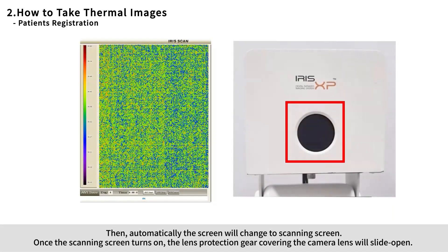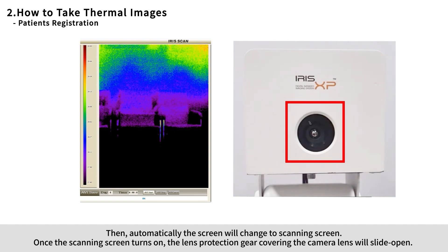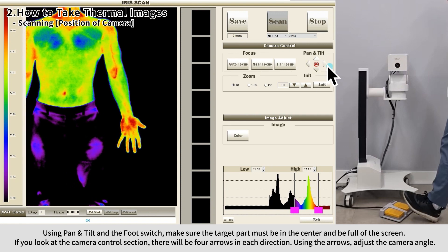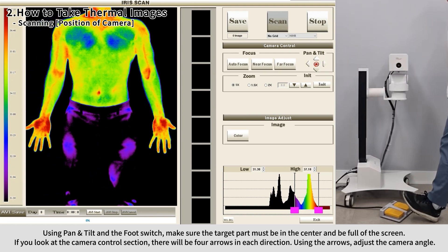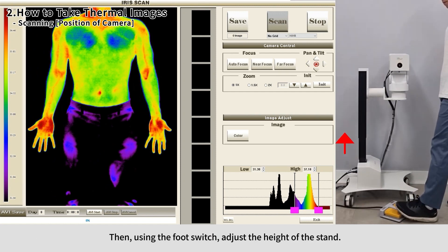The screen will automatically change to the scanning screen. Once the scanning screen turns on, the lens protection gear covering the camera lens will slide open. Using pan and tilt and the foot switch, make sure the target part is centered and fills the screen. In the camera control section, use the four directional arrows to adjust the camera angle, and use the foot switch to adjust the height of the stand.